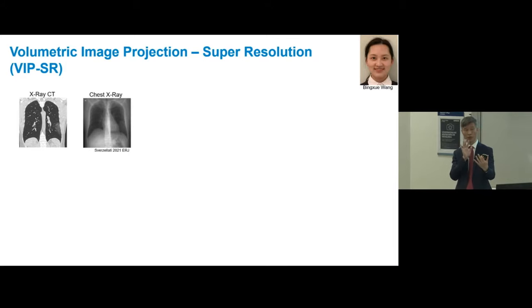It actually has all the volumetric information. It's just projected in one direction, so some things are overlapping over others, right? But you capture the volumetric information in that way. But one key difference between these two technologies is that chest X-ray is much, much less complex and a lot cheaper. Right? So really, 3D imaging is challenging. Can we take some inspiration from this concept?